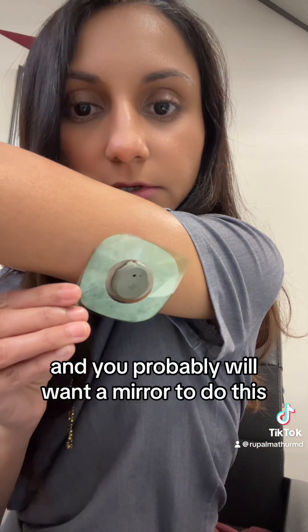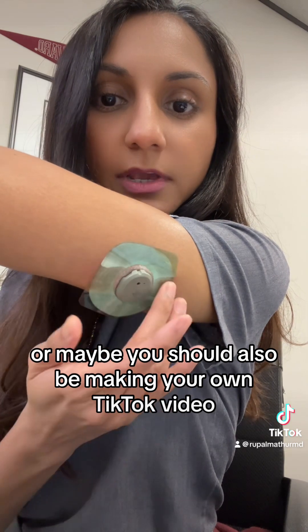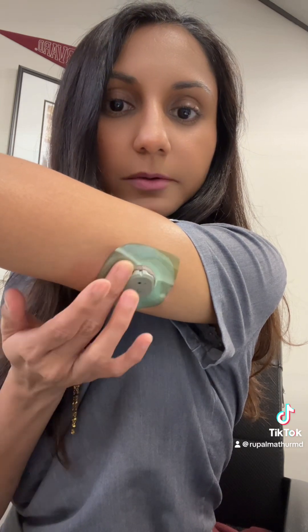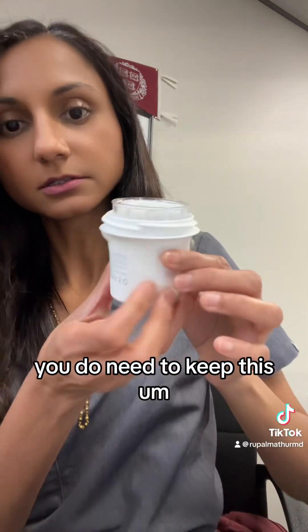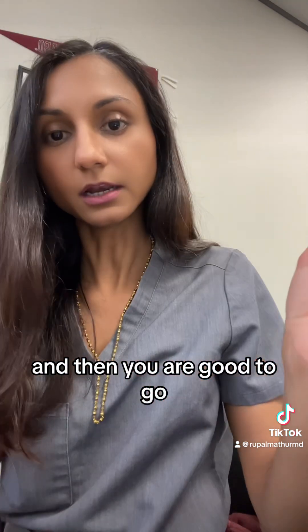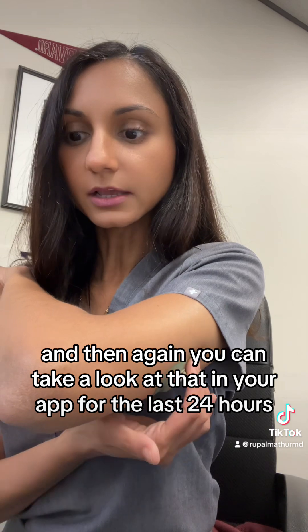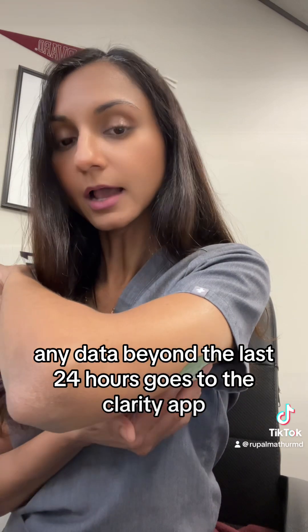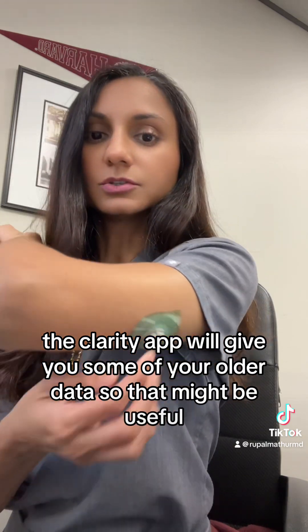You'll probably want a mirror to do this, or maybe you should be making your own TikTok video. There we go — now it's on me. The next thing to do is scan: this QR code gets scanned by your phone and that's how you start the warmup process. You'll have data in about 30 minutes. You can take a look at the last 24 hours in the Stelo app. Any data beyond the last 24 hours goes to the Clarity app, so even if you're not sharing with a healthcare provider, the Clarity app will give you your older data — that might be useful.